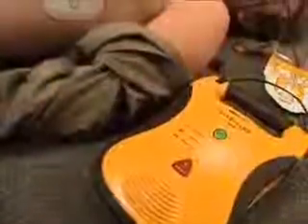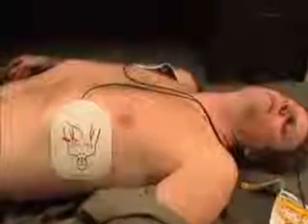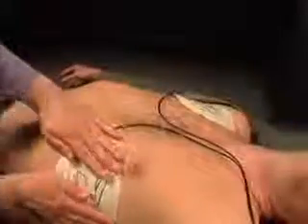For pad contact to patient, press pads firmly. The unit automatically checks the connection of the pads to the victim and lets you know if the connection is bad. Make sure the pads are properly attached to the victim and not touching each other. If needed, reposition the pads and dry or shave the victim's chest.